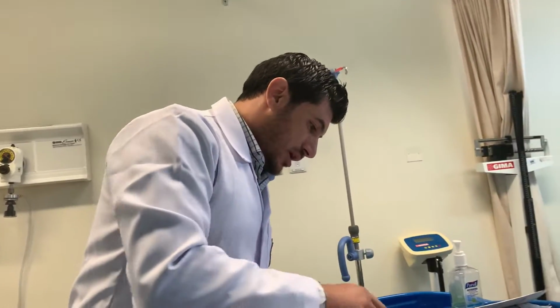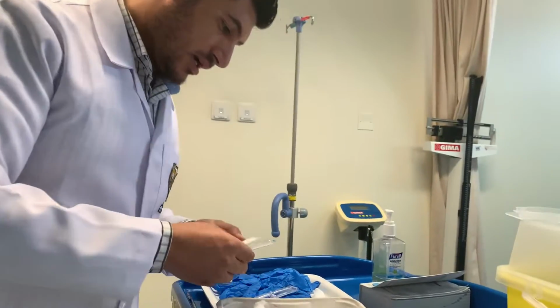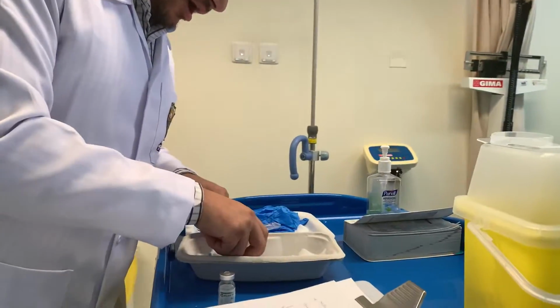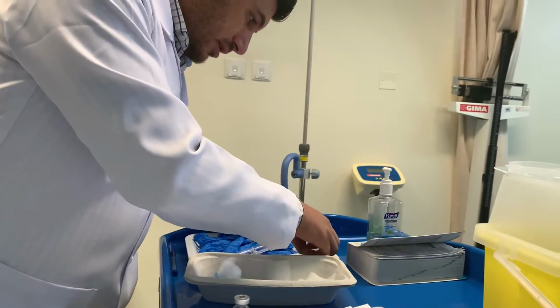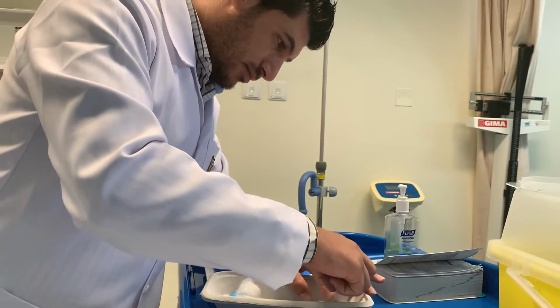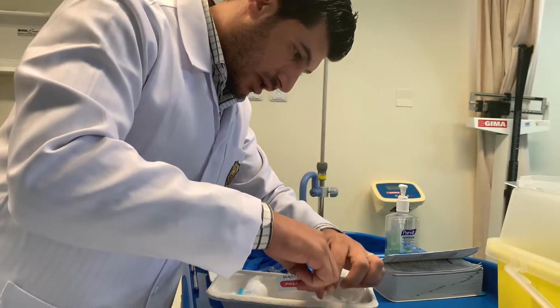My equipment will be the cotton ball. I need an alcohol swab. I need the syringe and an extra needle. I need a plaster, first aid in case there is some bleeding, and gloves.